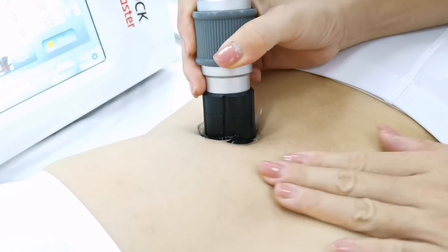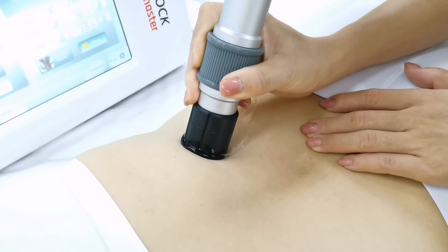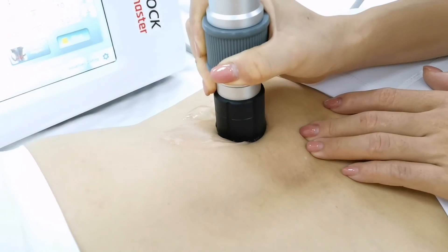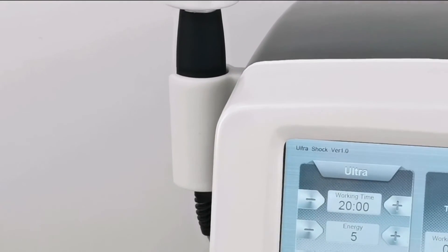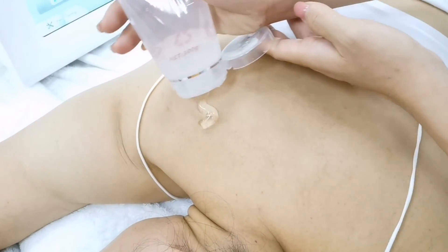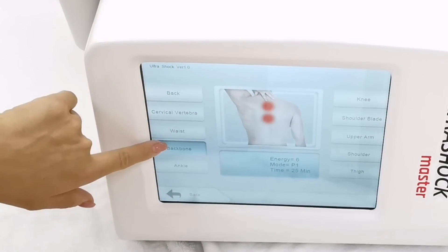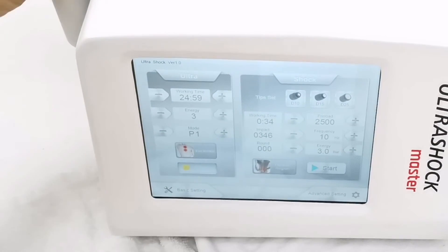Create a fist point and slowly move in a circular motion for heating around the treatment point, then move slowly across the treatment area. Adjust energy and frequency according to the patient's acceptance capacity.